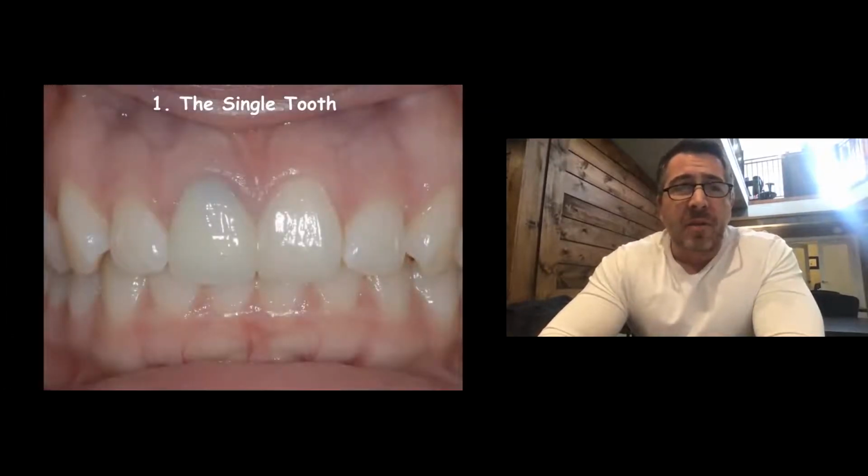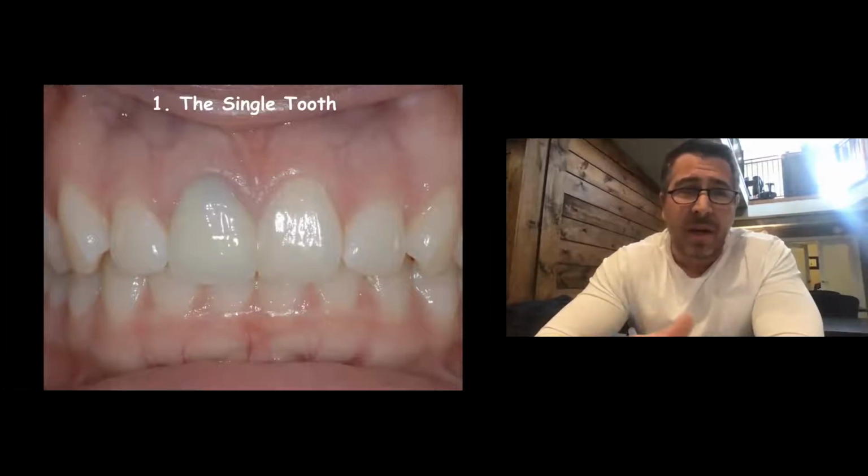So you'll see on this patient, she has a single central, a 1-1. She wasn't happy with it. Young patient, had endo. That's the second crown that we did for her. She wasn't happy with the graying of the tooth. The tooth underneath was black. It had a cast post in it. God knows why.